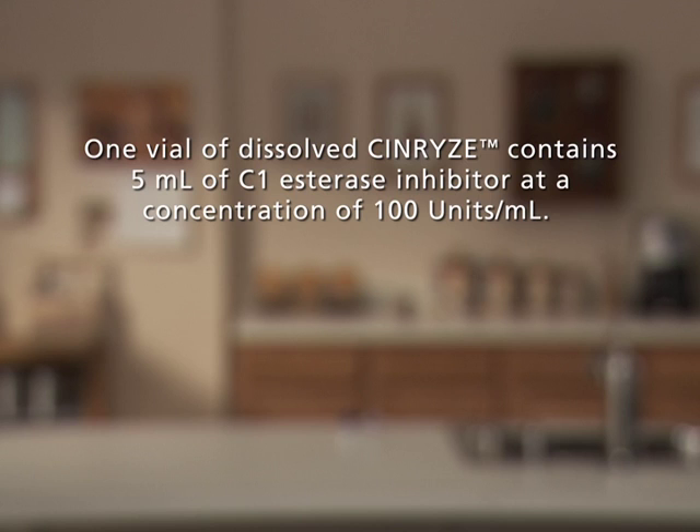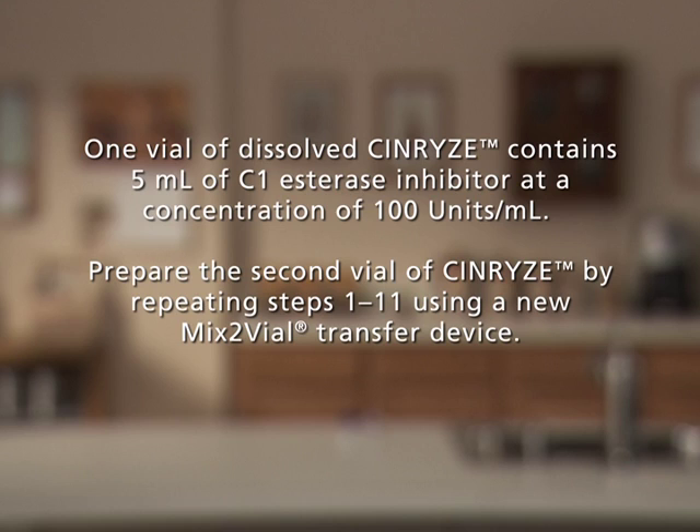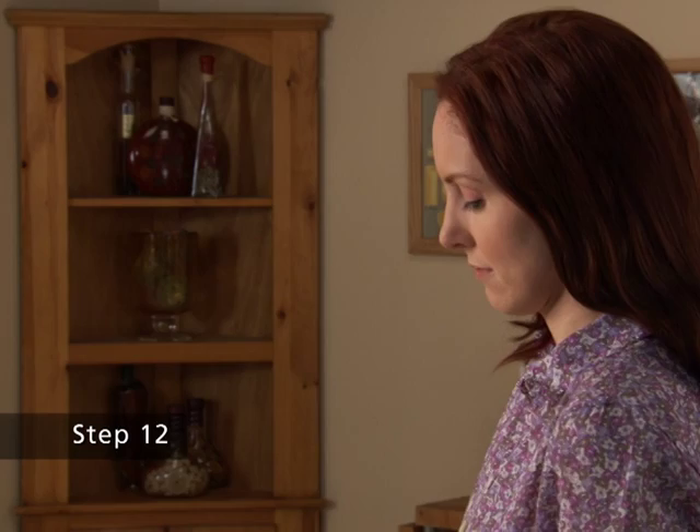One vial of dissolved Synrise contains 5 mL of C1 esterase inhibitor at a concentration of 100 units per mL. Prepare the second vial of Synrise by repeating steps 1 through 11 using a new Mix 2 vial transfer device. Do not reuse the Mix 2 vial transfer device.